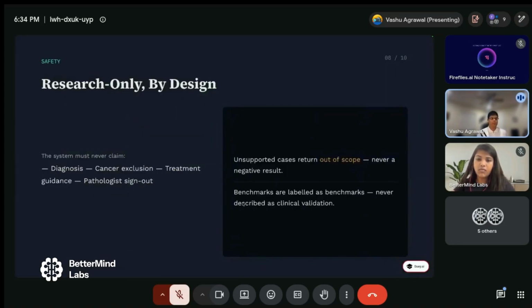And this is research only by design. So meaning that my website can never claim that it's 100% cancer detection accurate, because that does not exist. That can really not happen without a human reviewer. So these models just help pathologists speed up the work, because they quickly tell you, is it cancer, is it not cancer, and also the detailed regions of the cancer themselves. And so that really makes it easier for pathologists, and the workload will be decreased.